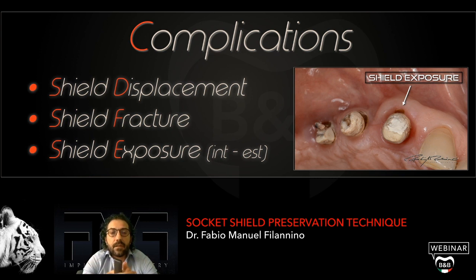And in my opinion, especially from the beginning, the authors were used to keeping the shield 1 millimeter above the crestal level, and shield exposure was more common.